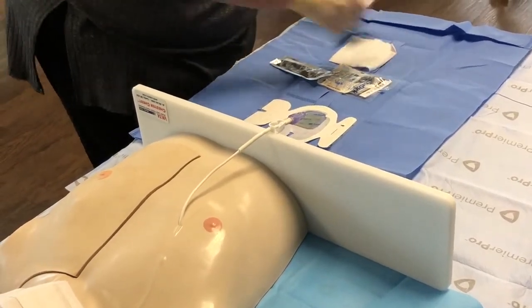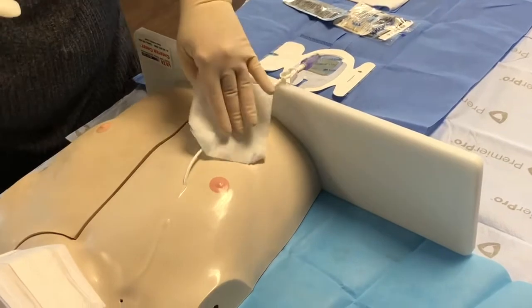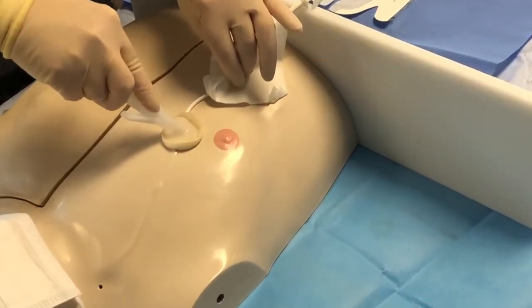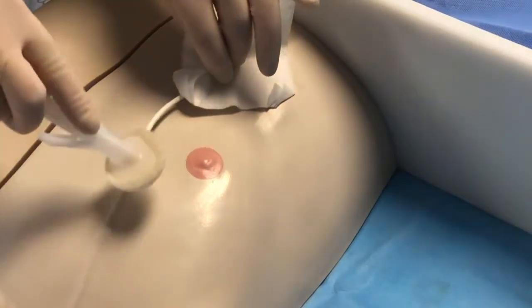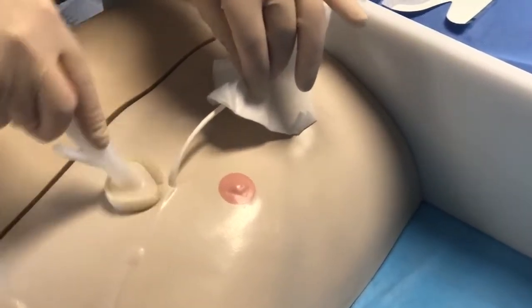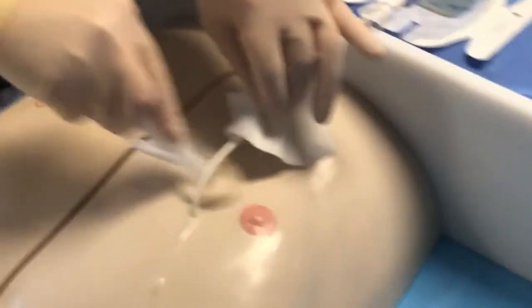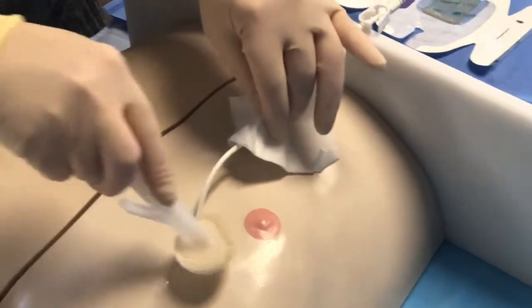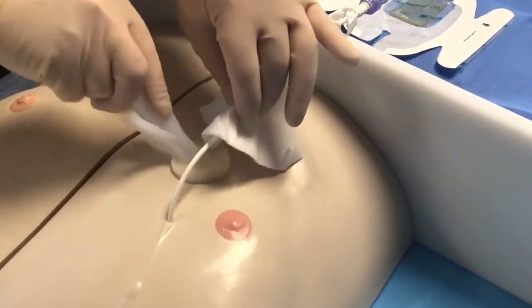Using one 4x4 to hold the catheter, pop the chlorhexidine swab and start by saturating the insertion site. Using a scrubbing motion, either hashtag or circular, work from the insertion site outward. Make sure that you do not go back to the insertion site. Scrub for at least 30 seconds.